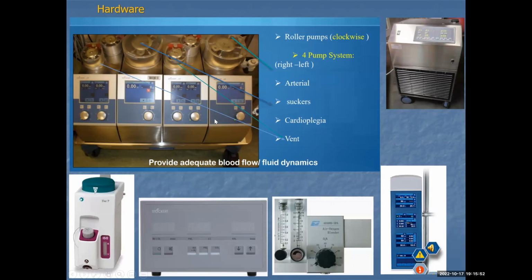And like I said, if you look at any other hospital, they will differ on the position of the pump. We have our pump opposite the surgeon. In other centres, they will have the pump behind the surgeon or the consultant surgeon. At other centres, they will have the pump at 90 degrees. So the orientation will depend on where the pump is positioned and what the centre chooses to use.